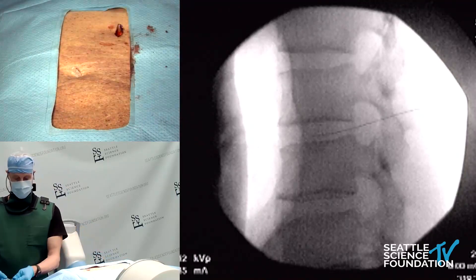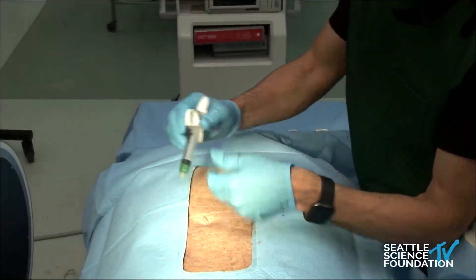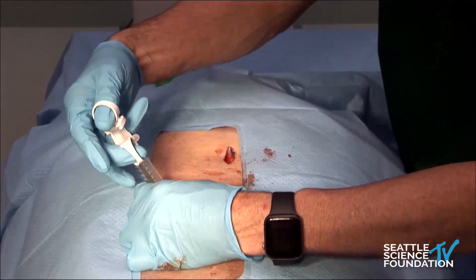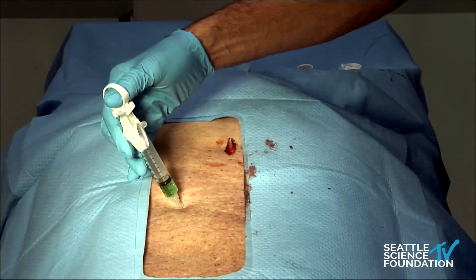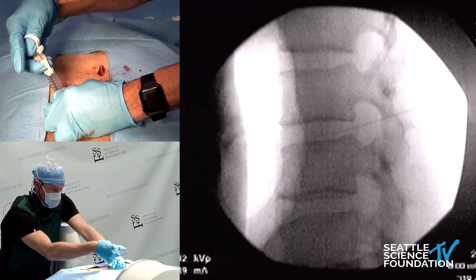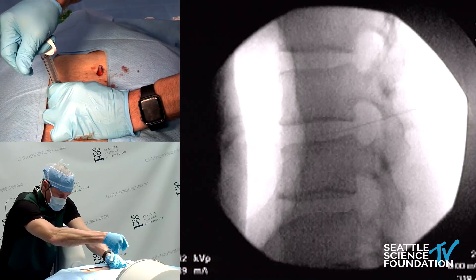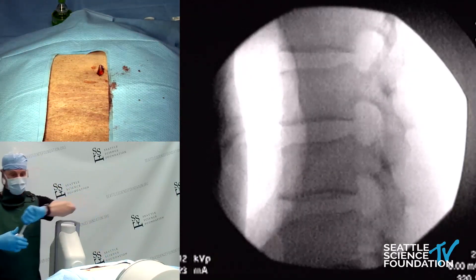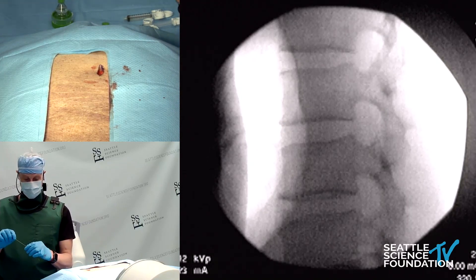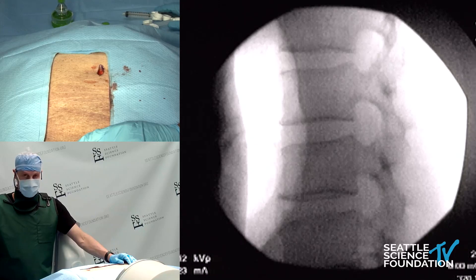We tent the skin to keep the needle dead center of the disc, then take the mixture of micronized disc material and cellular material and inject it directly into the disc. The VAST trial submitted for publication shows impressive pain and functional improvements. The average procedure time is roughly five and a half minutes for a single disc and eight minutes for two levels.